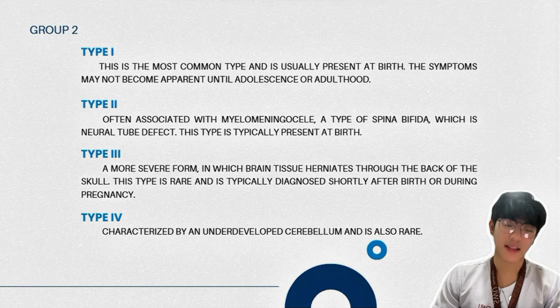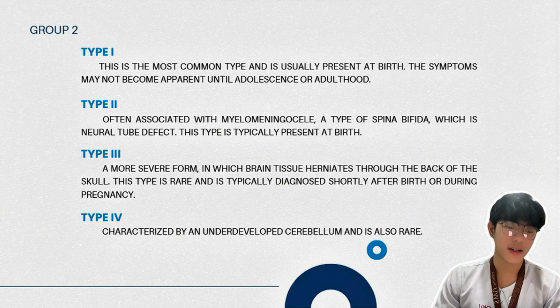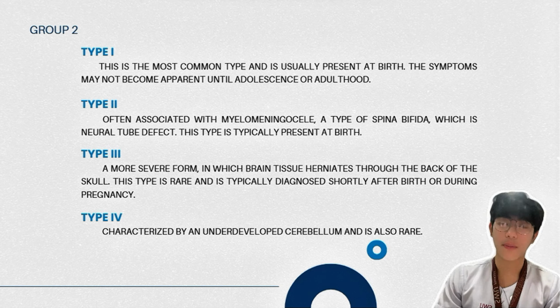There are four different types of abnormalities. Type 1 Chiari, in which there is herniation of the cerebellar tonsils below the level of the foramen magnum. This is considered the most common and often mildest form. Part of the cerebellum, the brain's lower part, pushes into the spinal canal. It may not cause symptoms but can lead to headaches, neck pain, or balance issues.